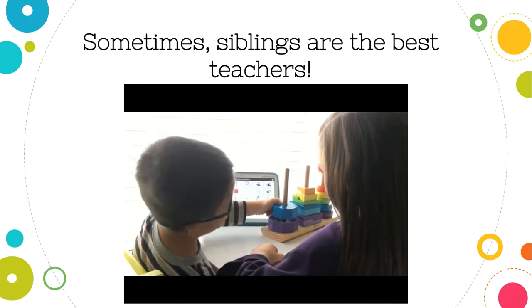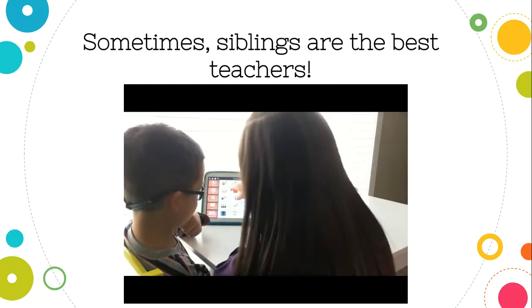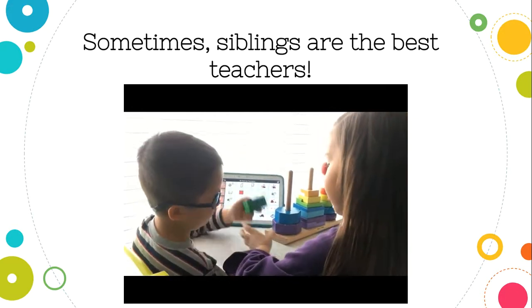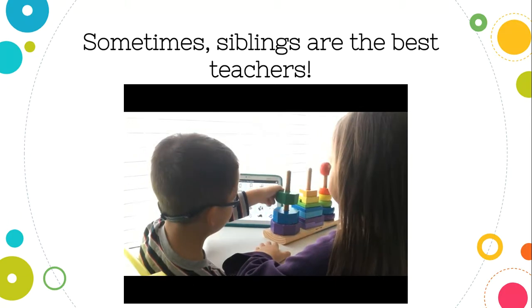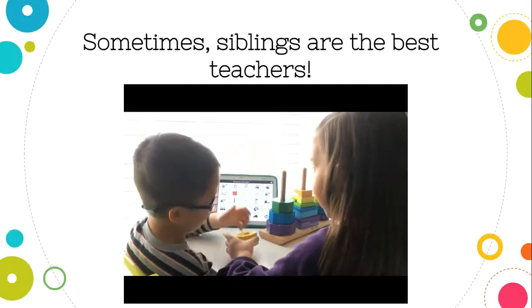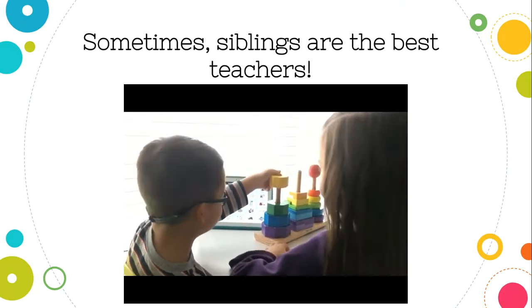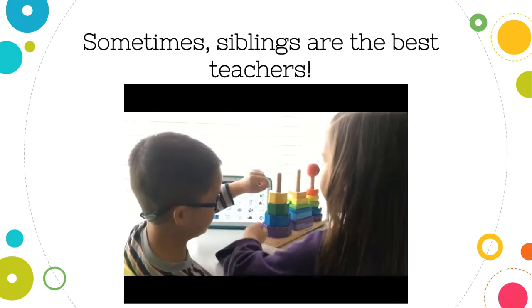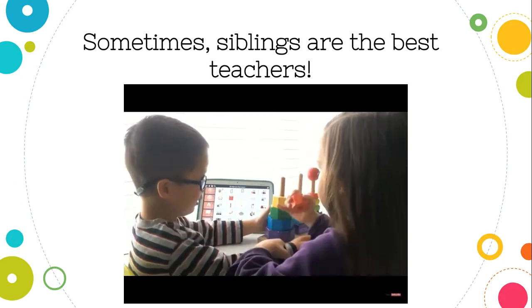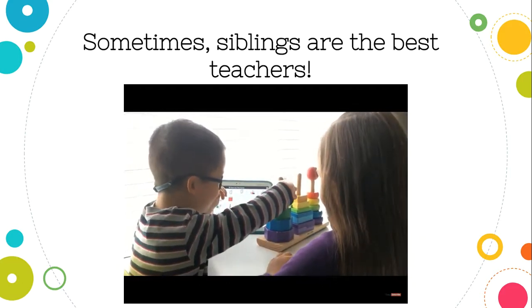Good. Now let's put green on top of blue. Wait. Yellow, so yellow ball on top of green. Let's put orange on top of yellow. Yay!